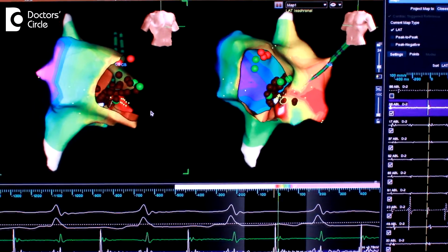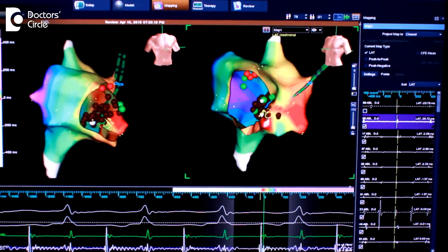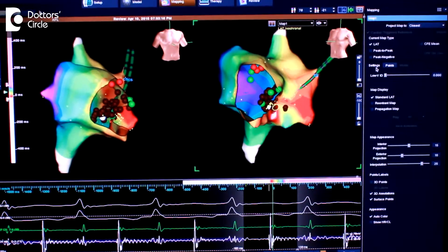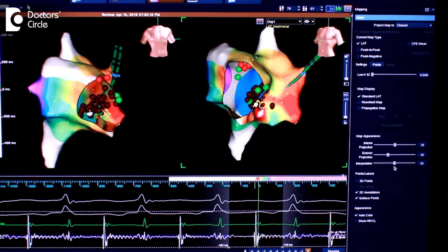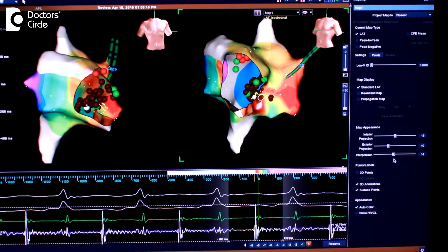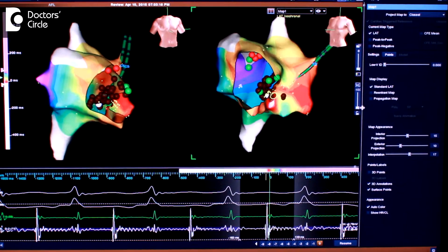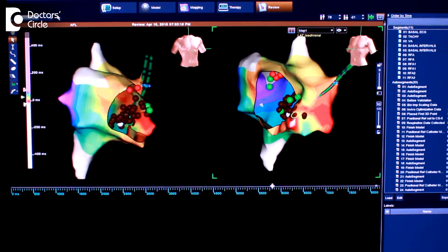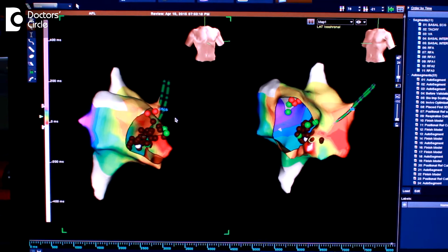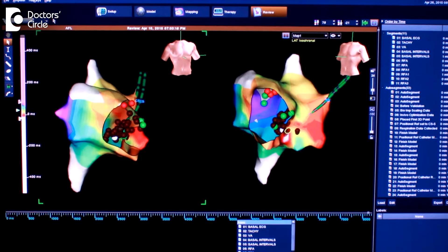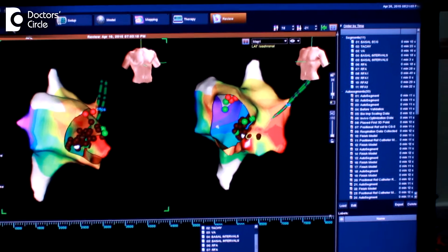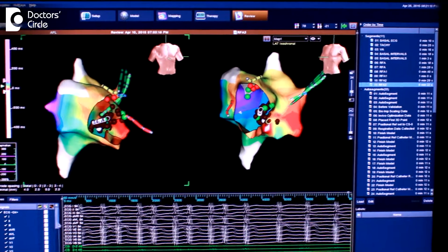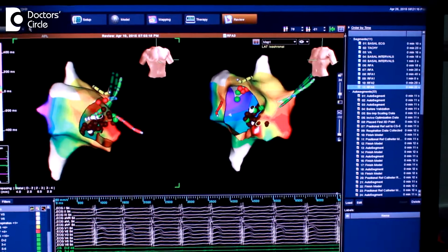This is a new advanced therapy for complex arrhythmias — we call it 3D insight — where we map the heart in its electrical form. These colors give us information about the spread of the electrical system through the heart, helping us identify exactly where the foci or point of electrical abnormality is. The dark red, deep red, and green dots indicate the places where we perform radiofrequency ablation. This approach is used for complex and difficult arrhythmias, takes about one to two hours, and is performed under local anesthesia. The patient is discharged after a day in the hospital, going home without any arrhythmias if the ablation is done successfully.